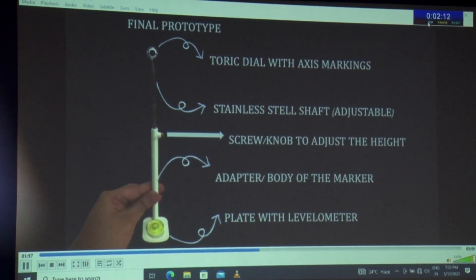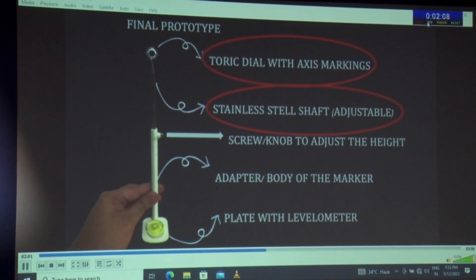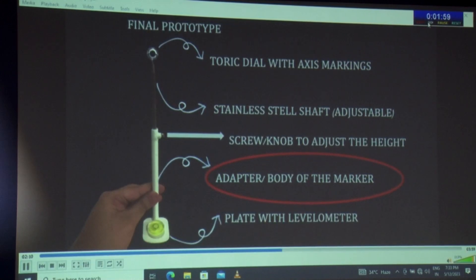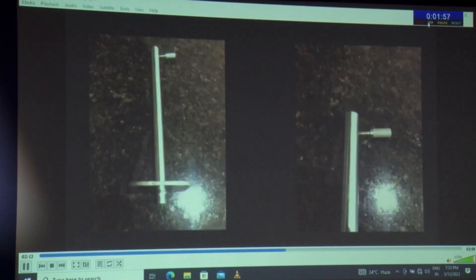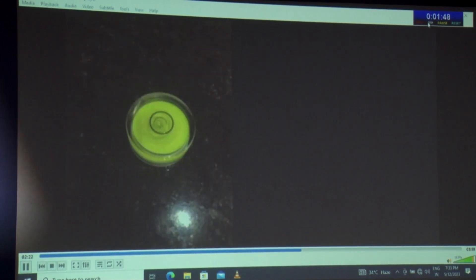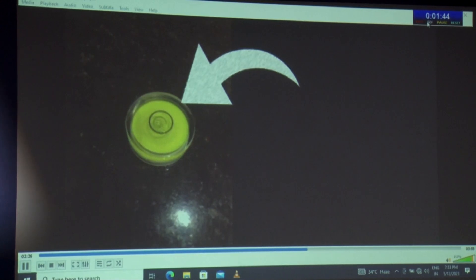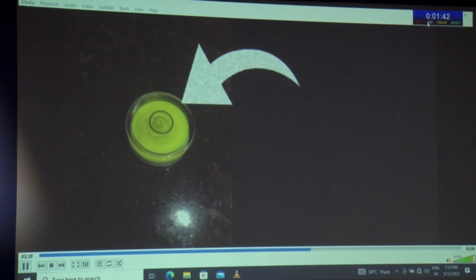The final prototype consists of a dial with a shaft made out of stainless steel. The dial is rotatable 360 degrees and has an atraumatic edge. The adapter or body of the toric marker is fitted with a plate to accommodate a levelometer called the bullseye levelometer. This bullseye levelometer ensures that the toric marker is perpendicular to the table of the slit lamp.